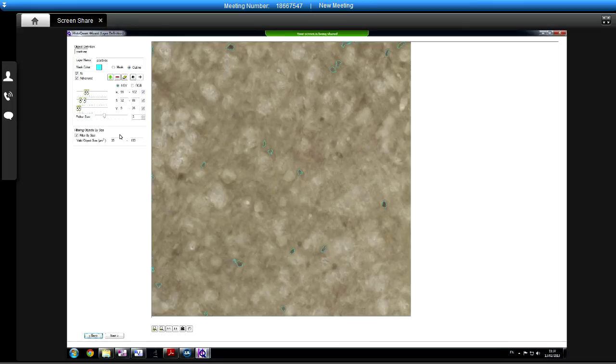So you need to, and over slides as well. So maybe pull out some 2 or 3 slides which are good representative samples, scan them, mark up a couple of training areas on each one of them, and then open each of them up in the training screen here and just modify the parameters and do a little bit of back and forth until you find a set of settings that averages out nicely across them, because of course you will get a little bit of difference in staining intensity and quality in slides made at different times.